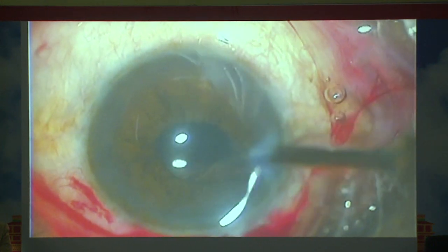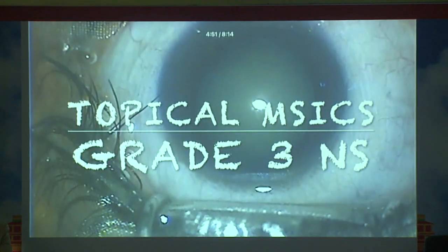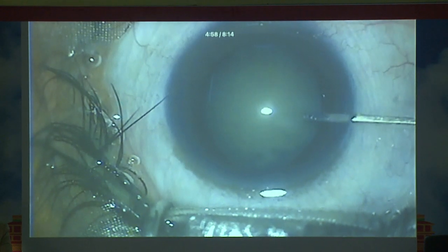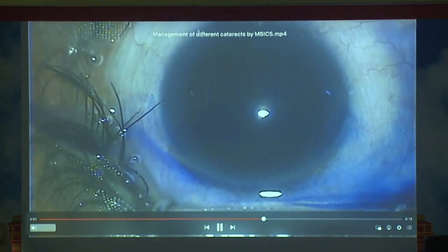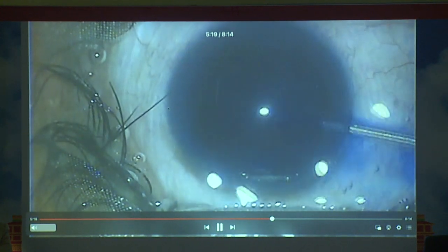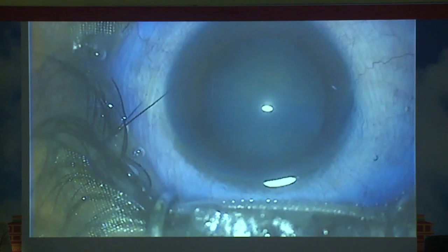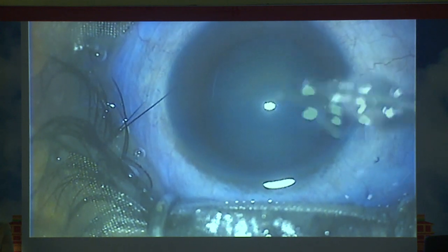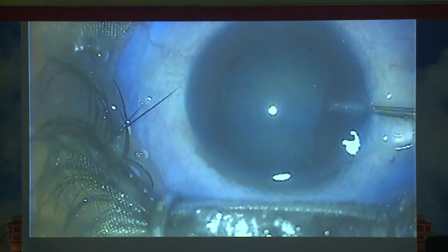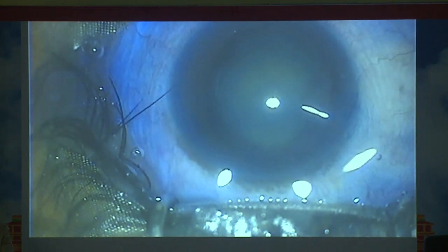In the same way, I would like to show you one more case from the same day. After my rhexis, the anterior capsule was stained. The capsule is a little elastic in young patients, and if you are not able to get a good CCC, which is very detrimental for your phaco, the rest of the steps become very difficult. So I went on with this.